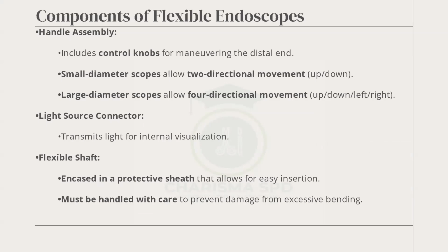They are operative instruments, so you have to direct them to get them to work. They have a light source; without that light source, you won't see anything. The shaft is embedded with lenses, so you don't put heavy instruments on them.